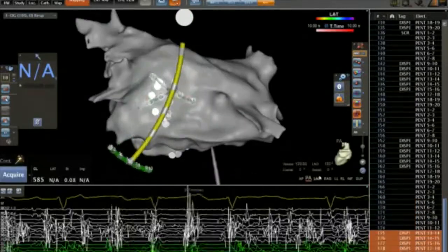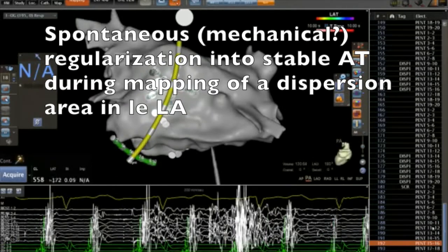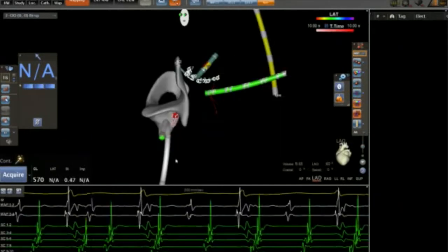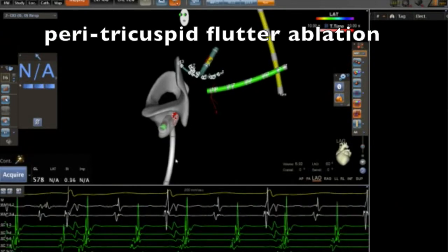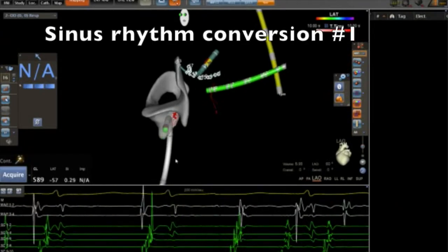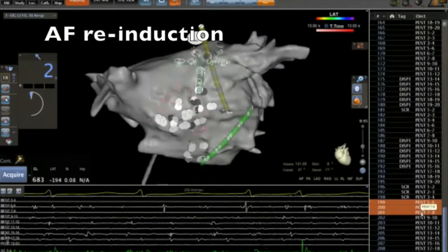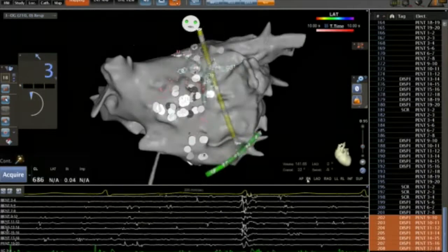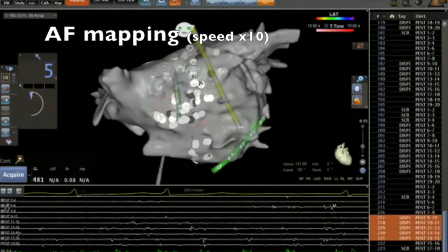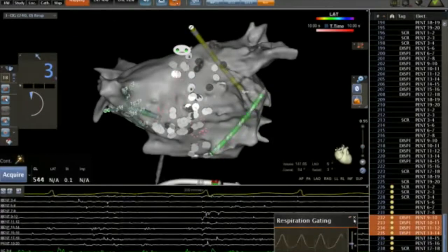During this dispersion region mapping, AFib spontaneously changed into a stable AT. This stable tachycardia corresponded to a peritricuspid flutter that we ablated successfully. Then we re-induced AFib with rapid atrial pacing at the proximal CS and continued the AFib mapping of the left atrium.